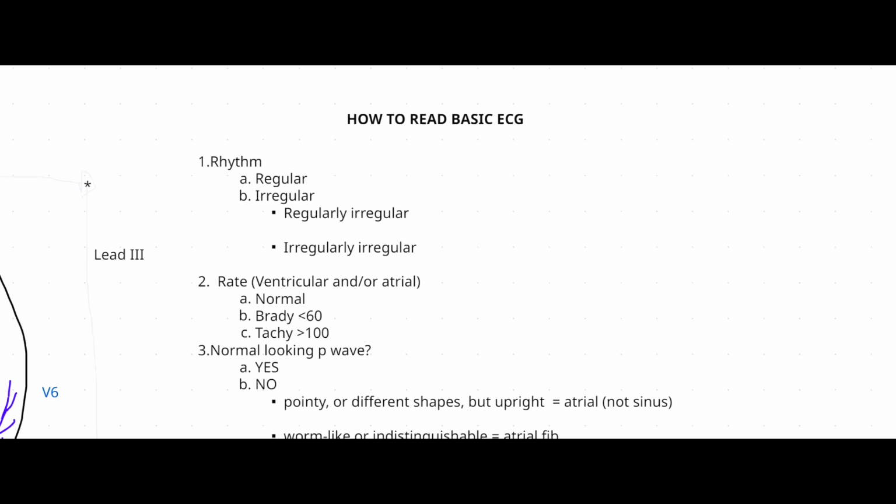I wouldn't want for you guys to start memorizing how they look. I really would love for you to just methodically go through each step that I'm going to put on here, because you can't go wrong when you go by the steps. You can't go wrong. Okay, it's just like a process of elimination. It's like, A versus B, because I'm going to outline it for you guys, so that it makes it hopefully a little bit easier to recognize the patterns based on description, not based on how they look, but I will draw some of it as well.